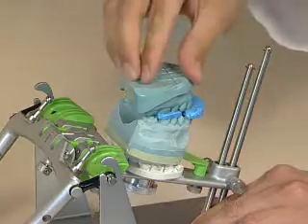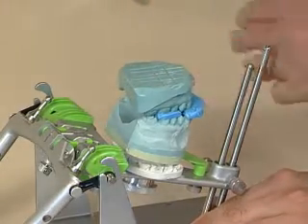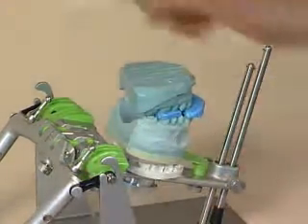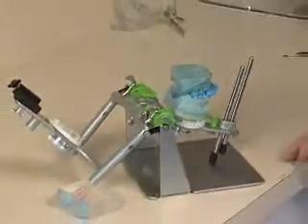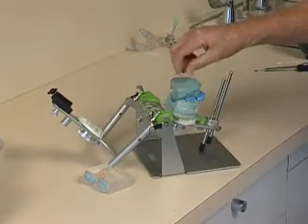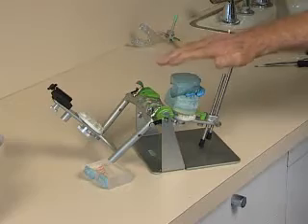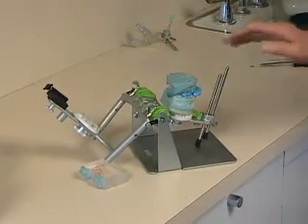Okay, now we have to make a judgment decision here as to whether we parallel it or we support the lower member like this. One of the two. So we parallel it just because we're going to put mounting stone on here, and if it's not parallel, the mounting stone will tend to fall off. So we want it parallel so the mounting stone will stay on the model good.